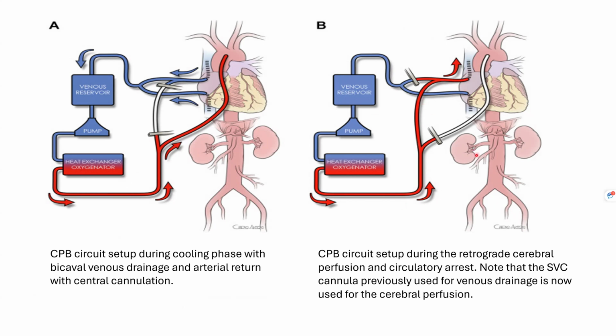As I said, the pump has a lot of tubing and a lot of clamps here and there, but I feel like this explains very easily how it is achieved. But again, you don't need to know this. I just thought it's cool.